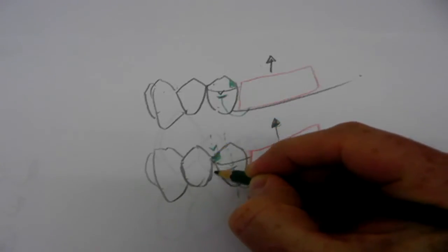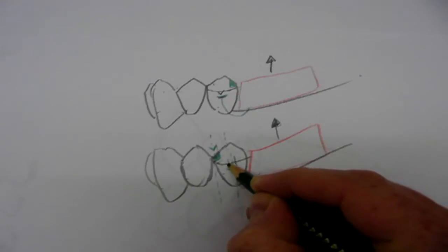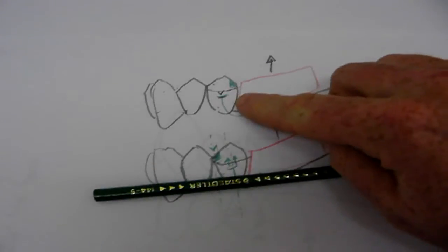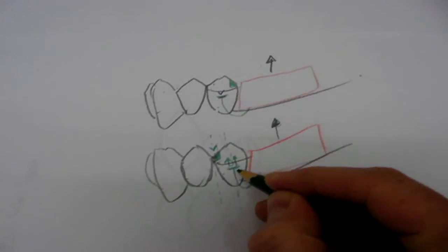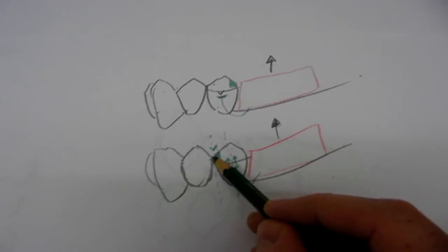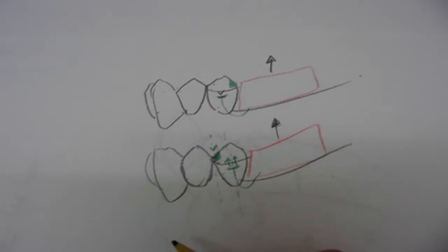So what actually happens is, as it tries to rotate, this occlusal rest becomes the fulcrum and the denture starts to rotate about that point there, which means the clasp tip has to move up the tooth bodily like this. So it's engaged in the undercut, and rather than rotating on the spot as in this scenario, it has to move up the tooth, and that means that the clasp is being far more effective, and this is called indirect retention. So indirect retention is really a method of changing the axis of rotation such that the clasp tip moves up the tooth bodily and improves the overall retention.